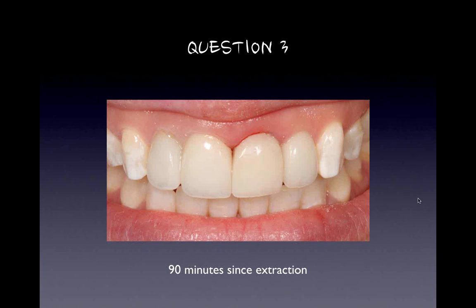Good question. Does the matrix bond the teeth together? I'm assuming you mean the four teeth are bonded together. Yes, they're bonded together. I split them up if I'm doing all four at once, and then I just do the interproximal contacts. So if I have to do it that way, I can do it that way. A lot of questions. Thank you.